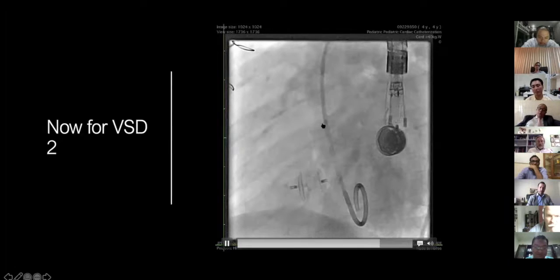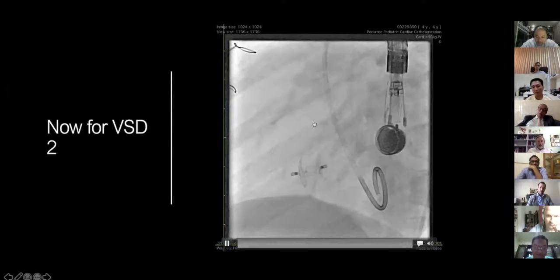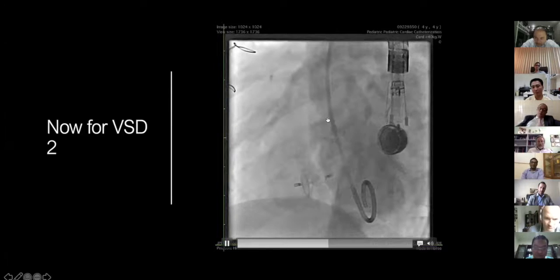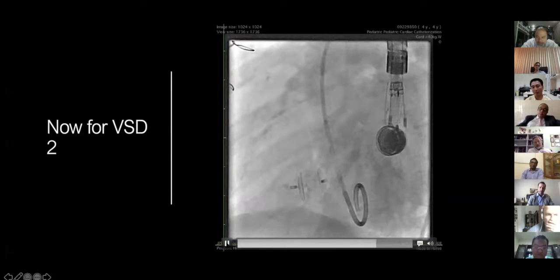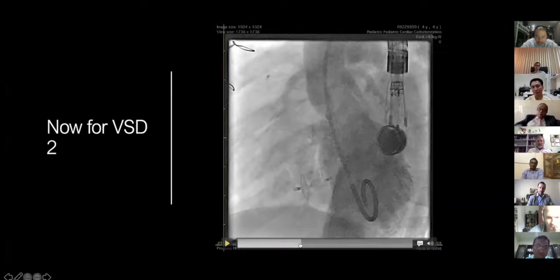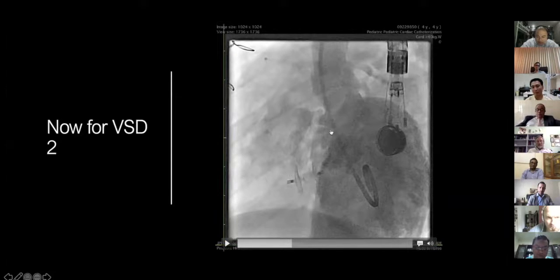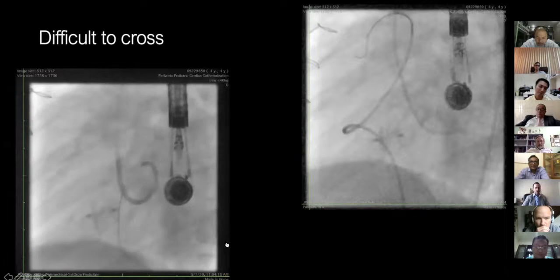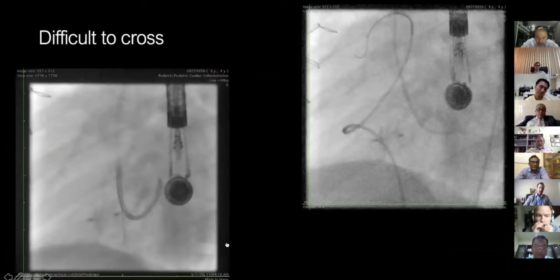Now, the other thing you can see now with this second defect is that there's probably 2 actual residual channels that go through to that right side. And you can see that the channel goes up and around. I'll try and pause that to give you a bit of a look, so you can see here it does this kind of loop up and around, and there's something else going underneath, and that's obviously residual patch defect.